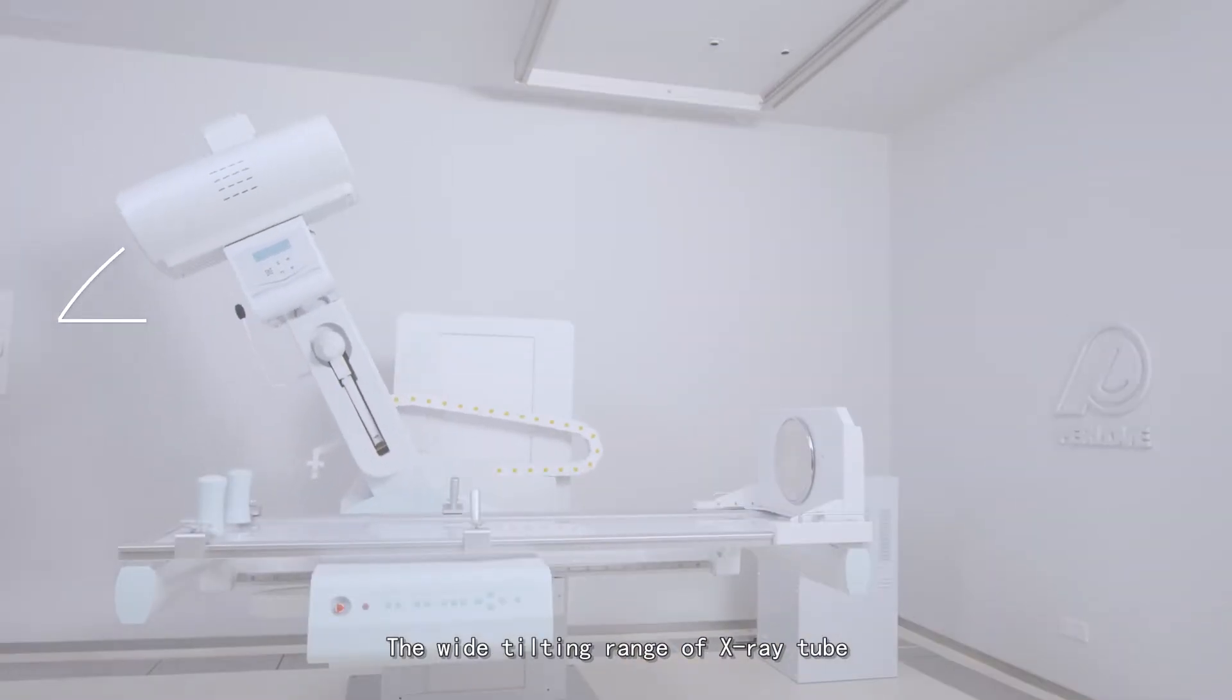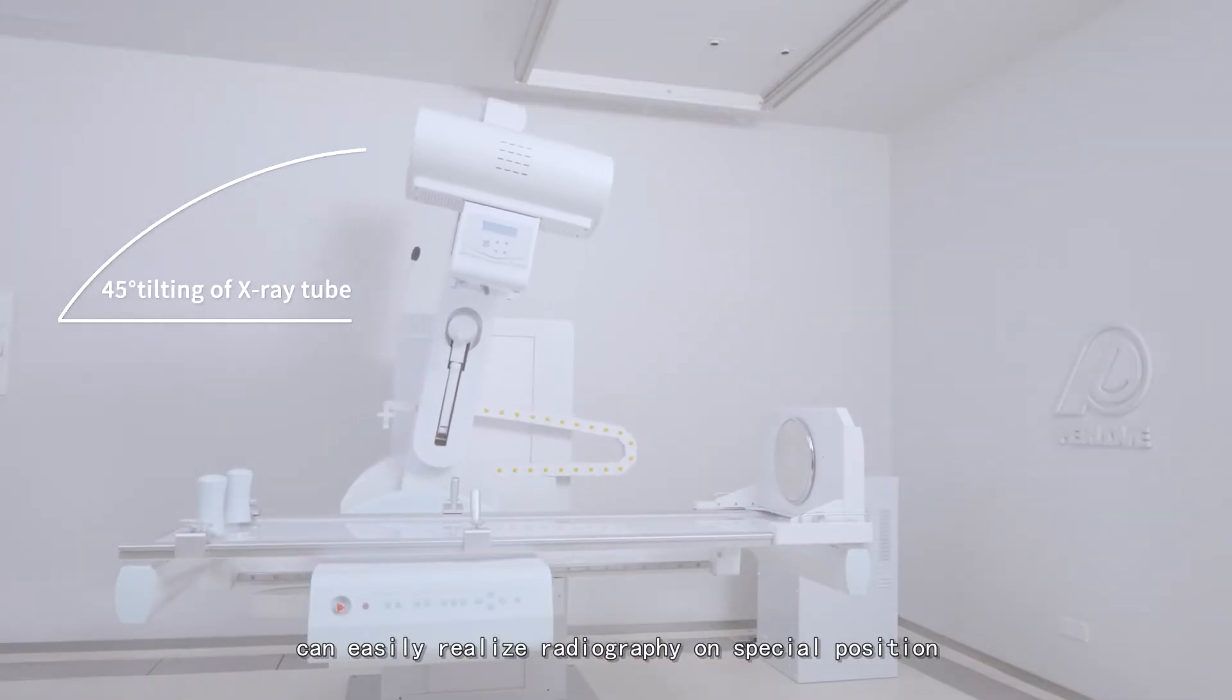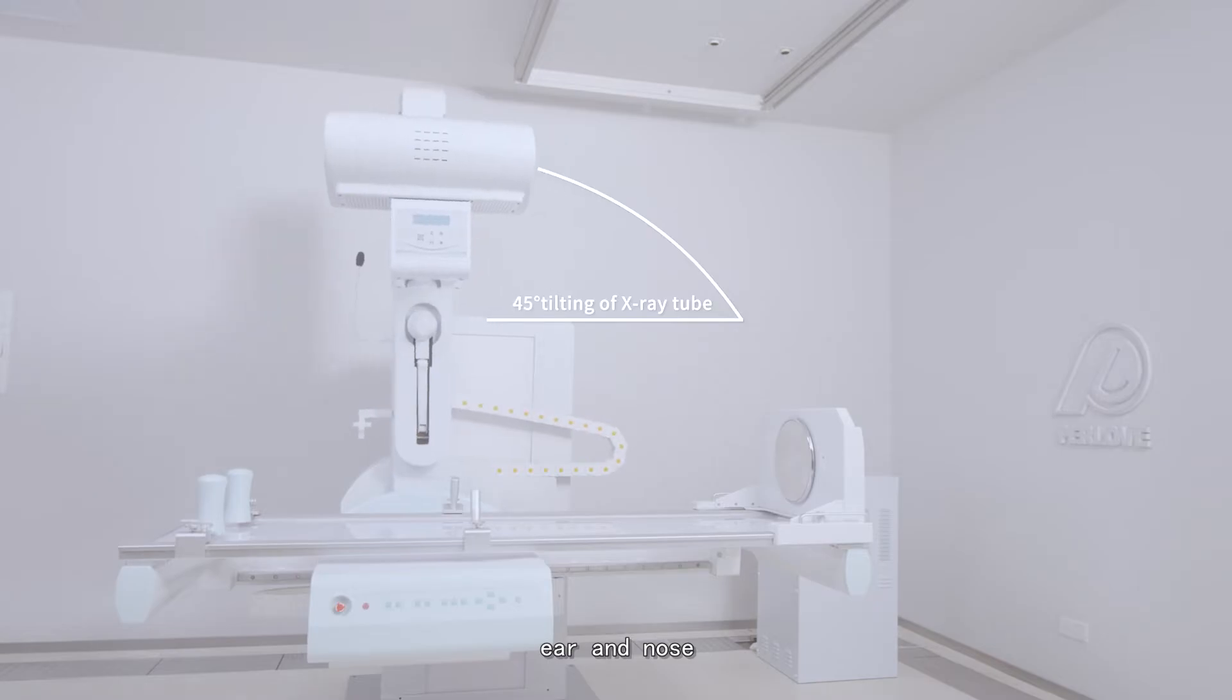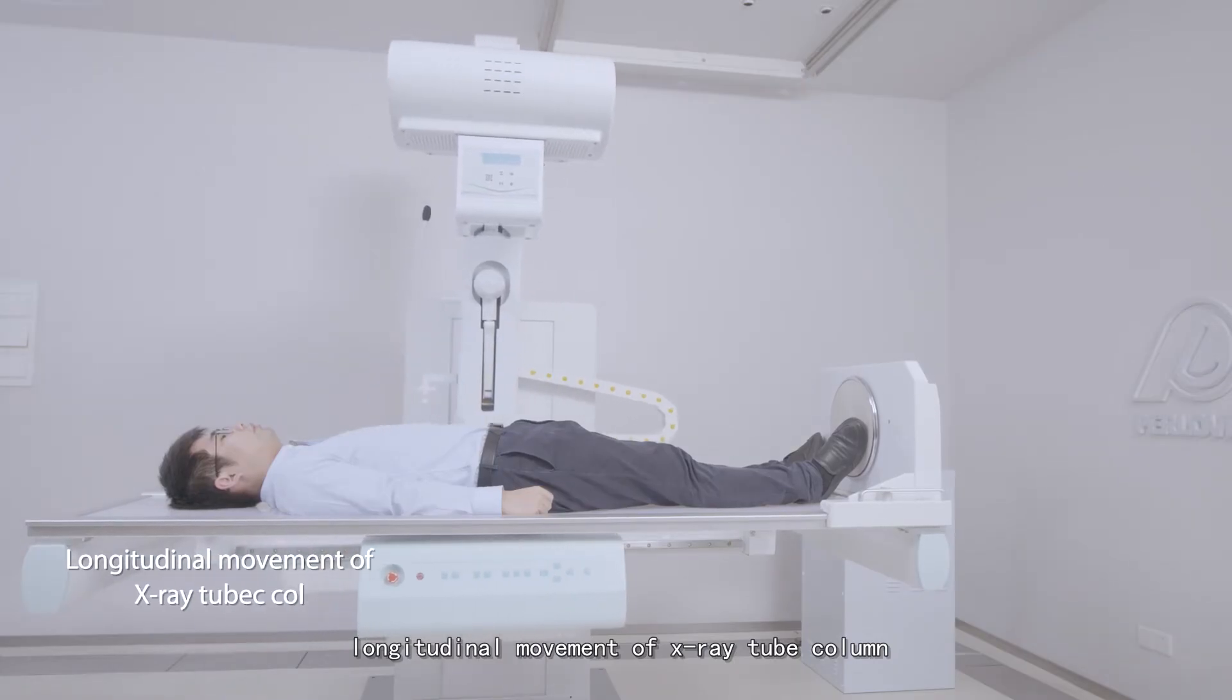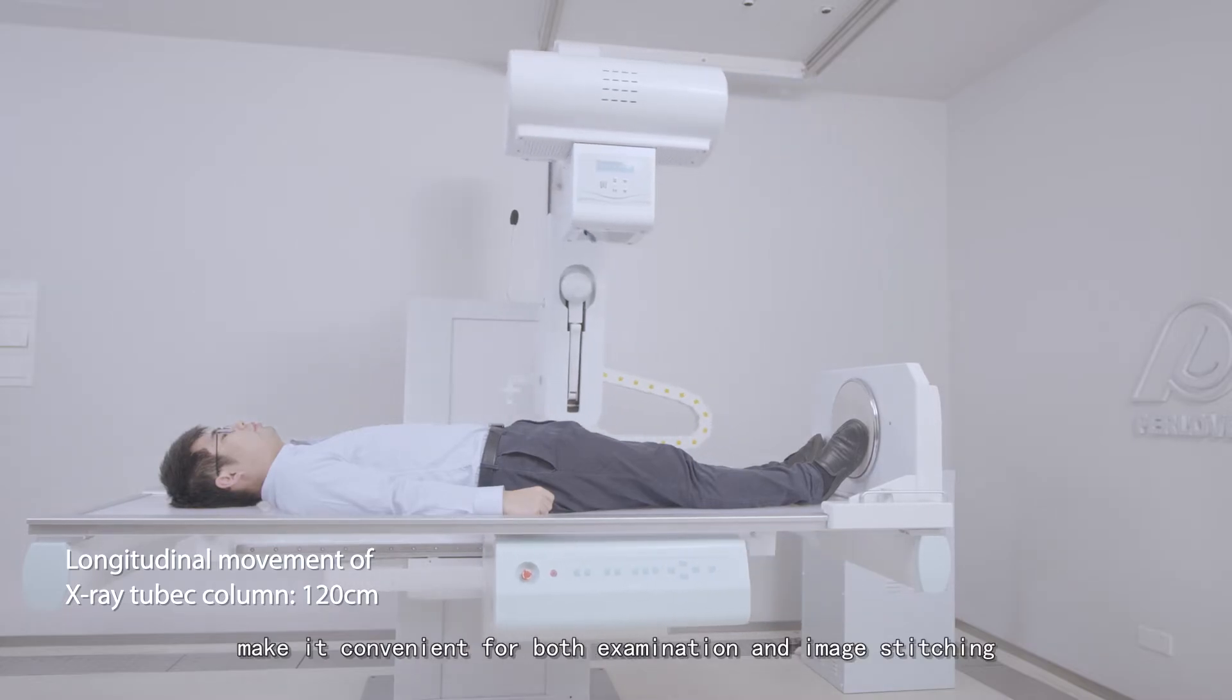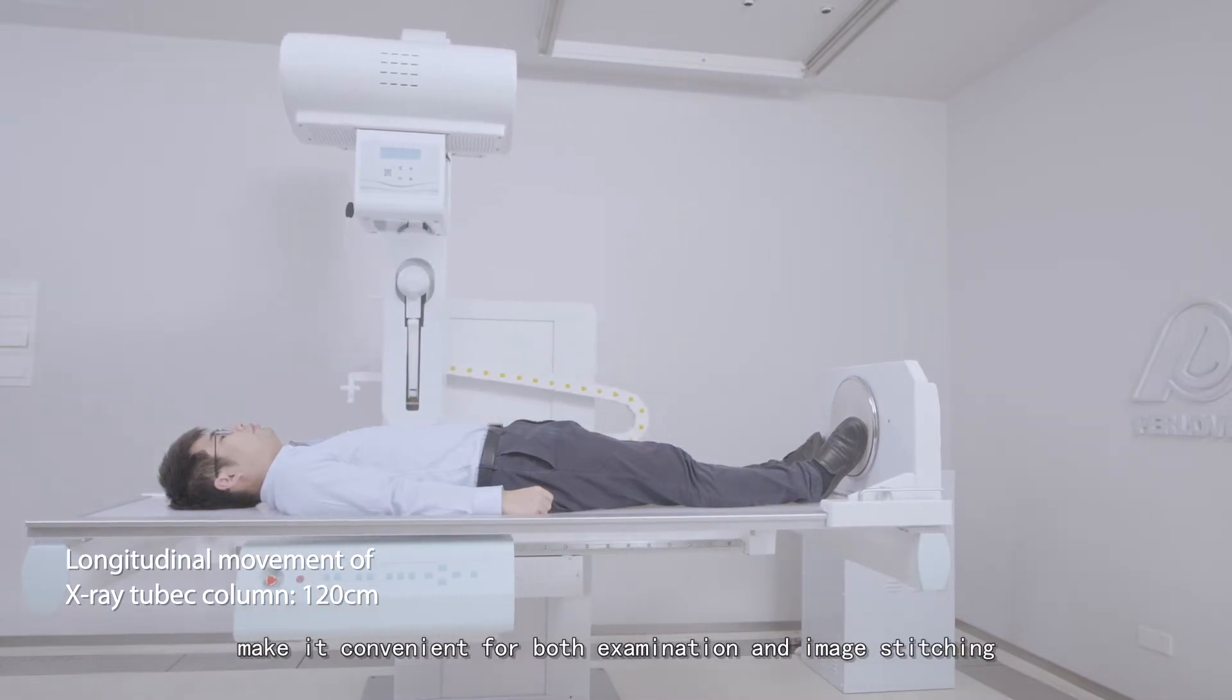The wide tilting range of X-ray tube can easily realize radiography on special positions, like radiography of patella, heel, ear and nose. Longitudinal movement of X-ray tube column provides large coverage area, making it convenient for both examination and image stitching.